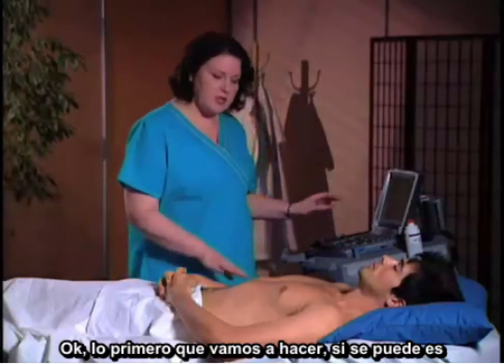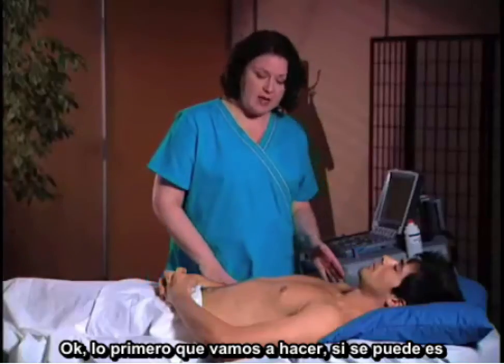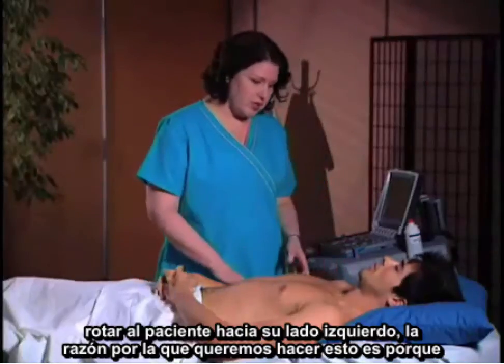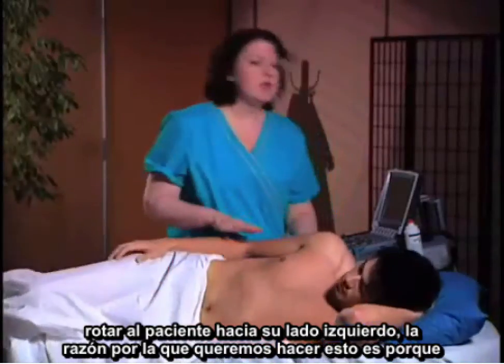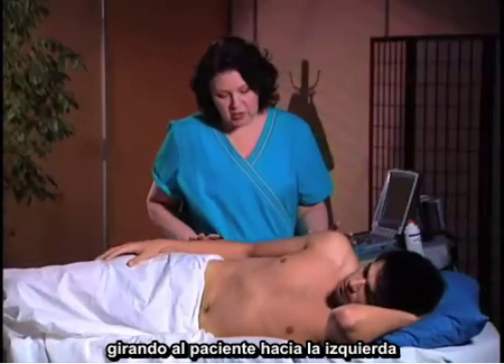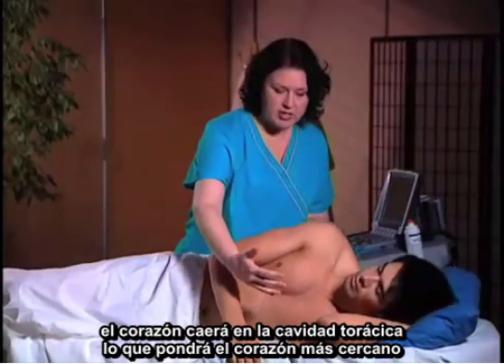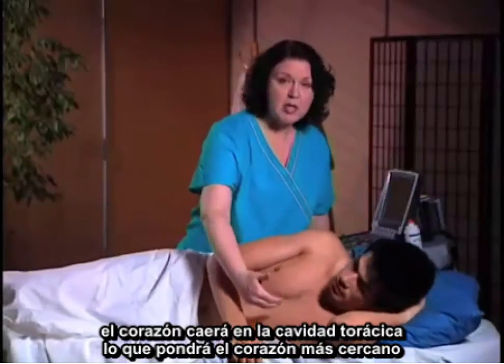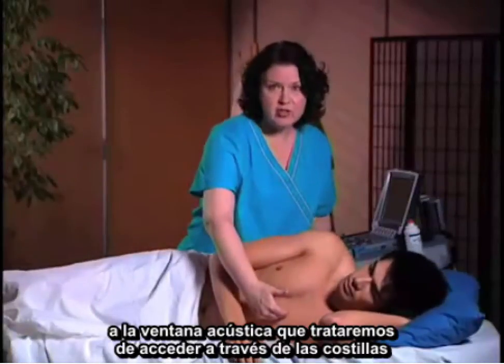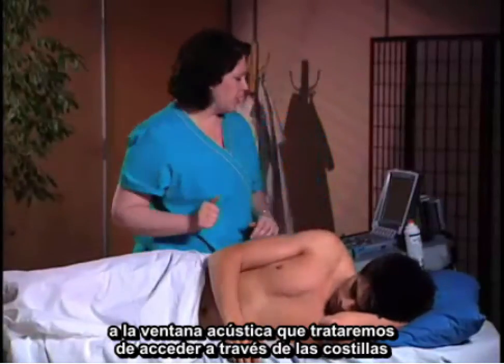The first thing you're going to do, if you can, is have the patient turn over to their left side. The reason we like to do this is as the patient turns to their left, the heart is going to fall forward in the chest cavity and bring it a little bit closer to the window that you're trying to access between the ribs.